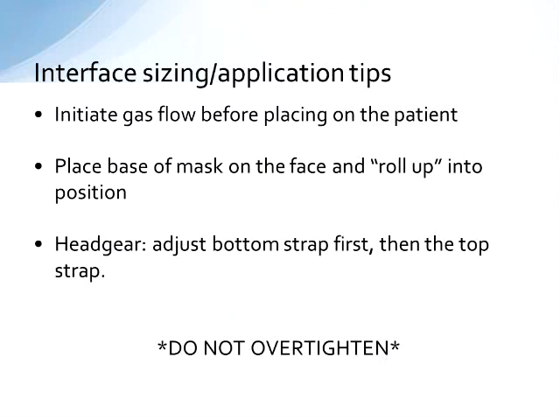And then whichever mask you've chosen, if it's the oro-nasal mask, the Pixie mask, just the nasal mask, you want to place the base of the mask on the face first and then roll it up into position. Once you've rolled it up into position, then you want to adjust the bottom strap. If it has two straps, you want to adjust the bottom strap first and get that nice and snug, and do the top strap second. If you follow this simple guideline, turning on the flow, starting at the base, doing the bottom first and then the top, you're less likely to over-tighten the device. And we know that over-tightening of the headgear can be really uncomfortable for your patient, but can also lead to those dreaded skin breakdown events in patients. So we want to avoid that.